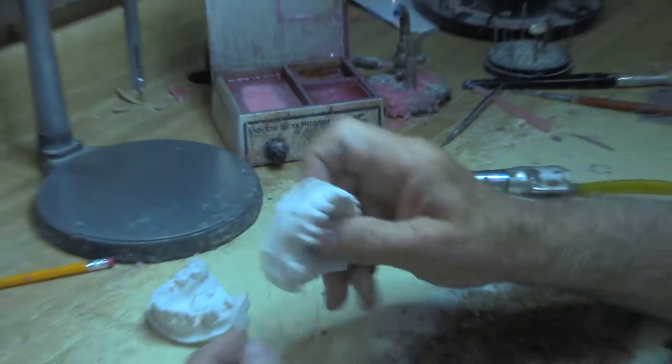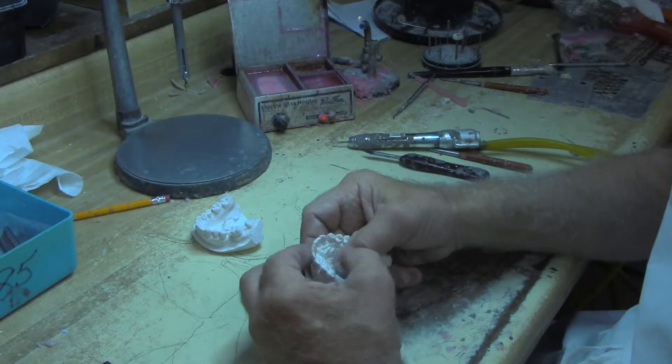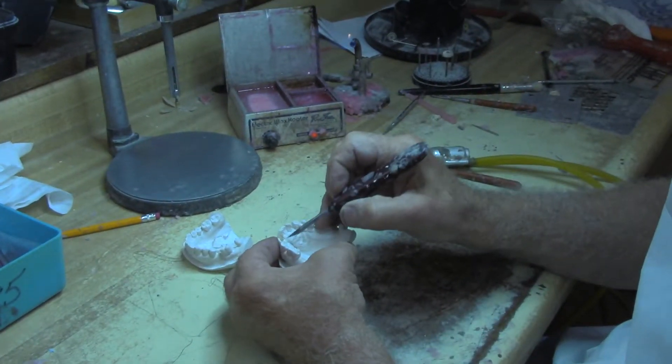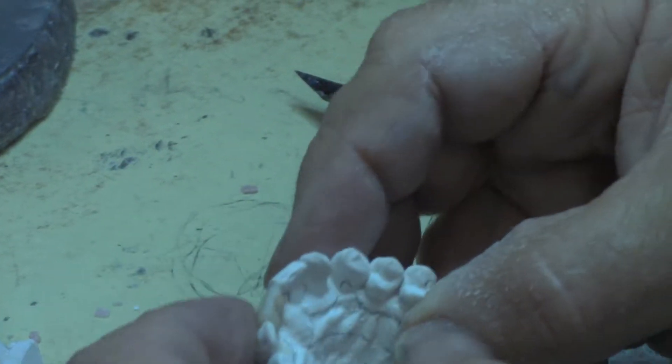Now what I'm going to do is take it and secure it on my model with wax on the outside, and I'm going to leave it just like that. I'll probably fill in right here with some wax to hold it there.